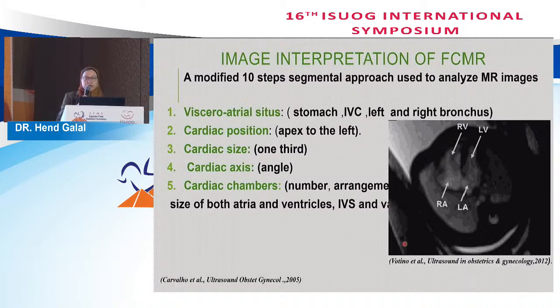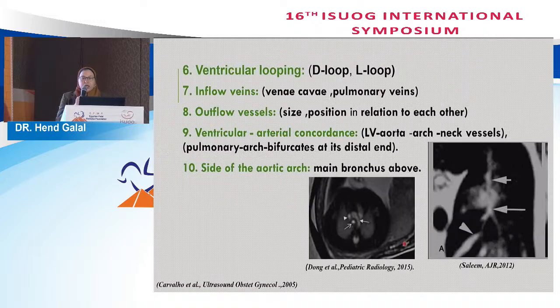As regards the image interpretation of the fetal cardiac MRI, we use a 10-step segmental approach, a modified approach to analyze the fetal cardiac MRI, starting with visceroatrial situs, cardiac position, size, and axis, and number of cardiac chambers and their relation to each other.